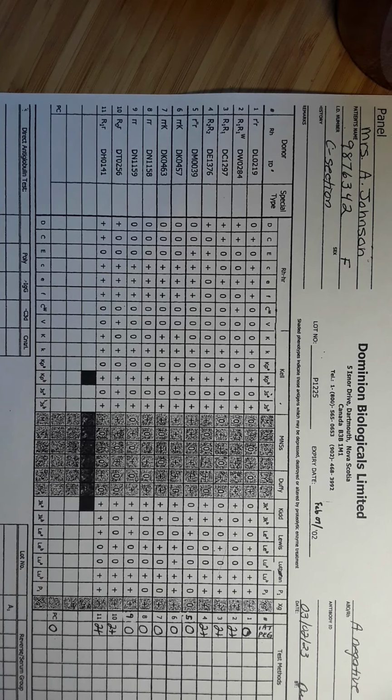So the next thing we're going to do is check the strength of the reactions. This is on page 9. I'm following the steps, and we're on step 2. The strength of the reactions are either negative or 2+, the whole way down. I don't see a bunch of variation, like negative, 1+, 3+, whatever. If I do see that kind of variation, I'm more concerned that there might be more than one antibody present. Today, for our first antibody, we're starting with a fairly simple situation, and there's just one antibody present in this patient's plasma. So we're going to start excluding.